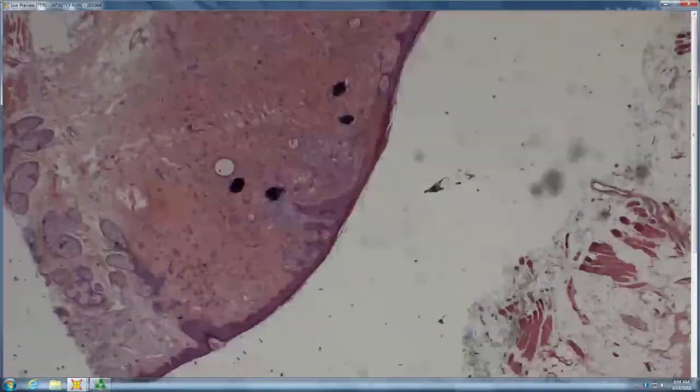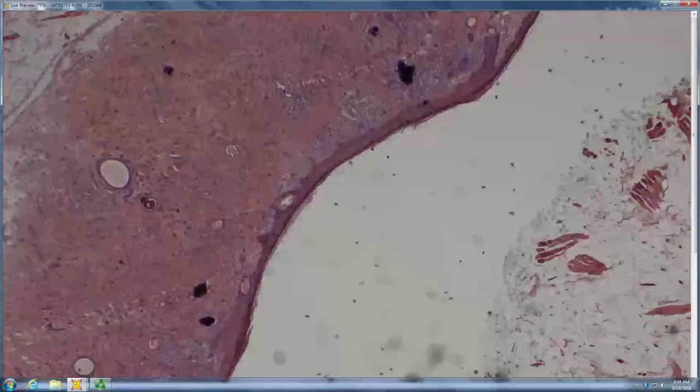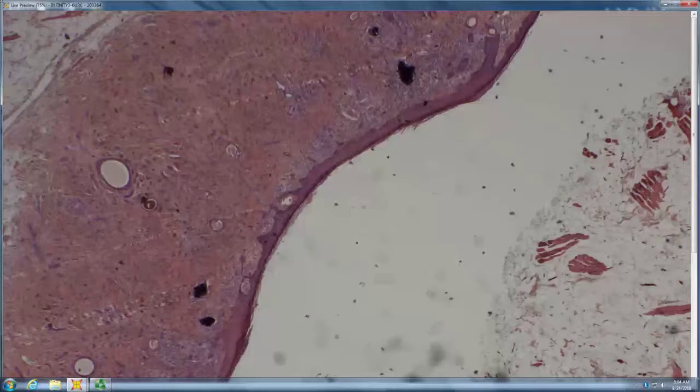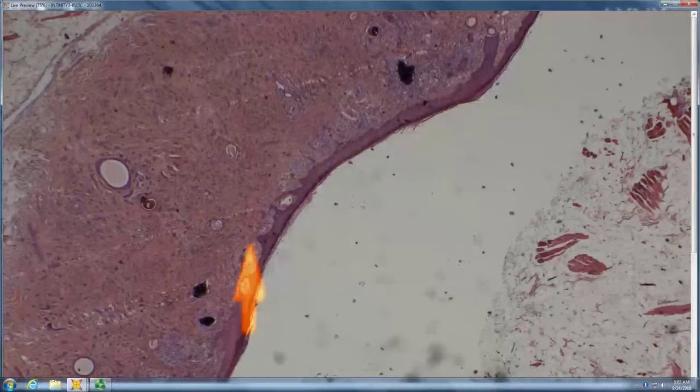There are humps on both sides and a depression in the middle. How might you characterize that? A dell, a central dell. So you have calcification, you have horn cysts, you have paisley tie in a desmoplastic stroma, a central dell, desmoplastic trichoepithelioma. Exactly. There are some other things with a central dell.